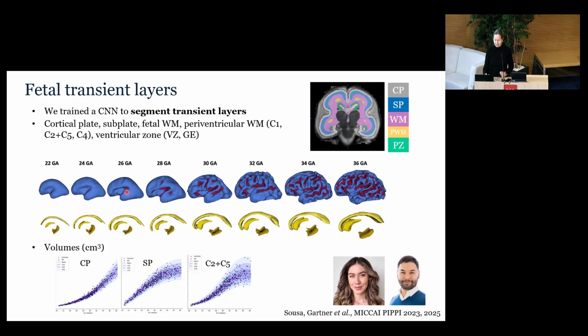And then as the folds deepen, like the sulci deepen, the subplate is disappearing. Every time a sulcus goes in, the subplate disappears. You can see these holes appearing where the sulci are appearing. And at 36 weeks, it's already quite discontinuous. As it goes with neonatal development, you will just have remnants of it. So it will continue disappearing.